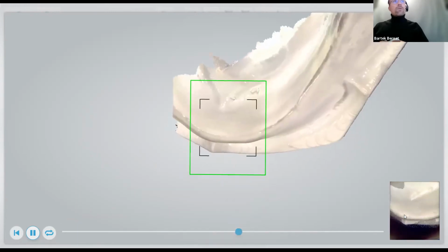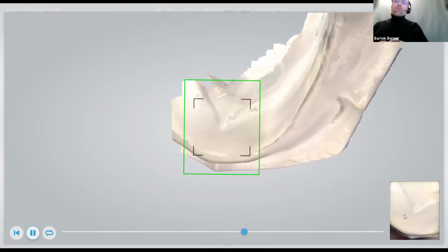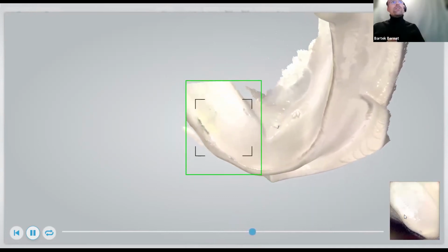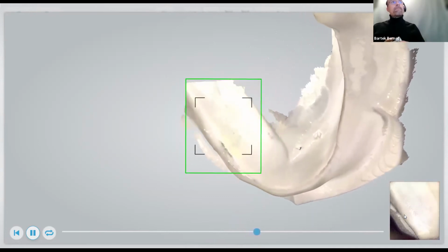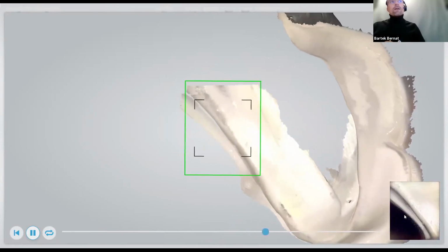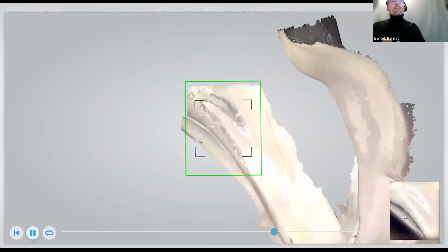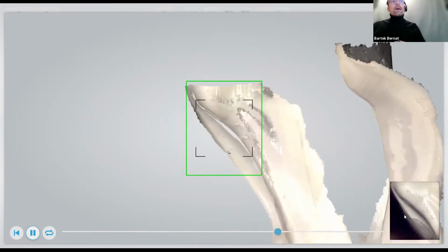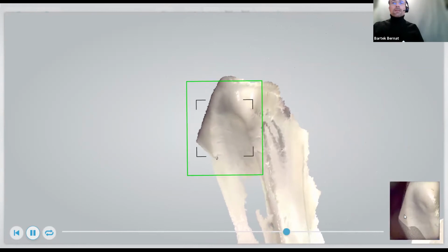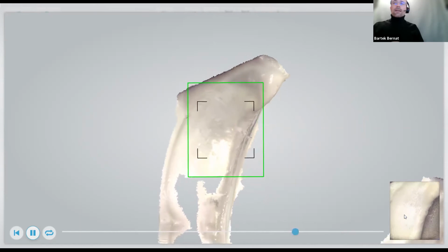Yep. So restarting in the midline, and now we proceed towards the retromolar area, staying a bit on the lingual aspect of the ridge, exactly as I was doing it here. Yep, we went to the very end as far as possible, and then turn into the buccal aspect of the ridge. And I'm going to go to the end without stopping the scanner right now.